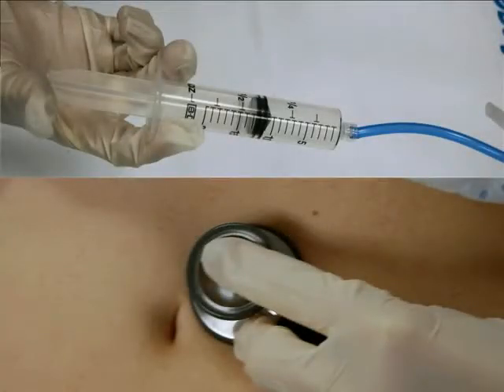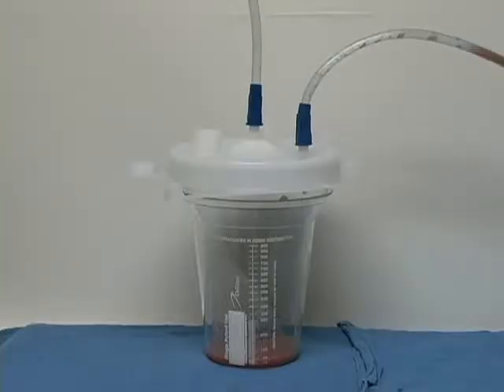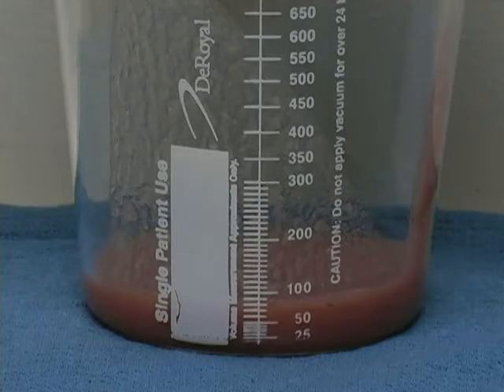To confirm NG tube placement, auscultate the stomach while simultaneously injecting 20 milliliters of air through the nasogastric tube. You should be able to hear a rush of air with the stethoscope. Alternatively, connect the tube to wall suction, watching for the aspiration of gastric contents.